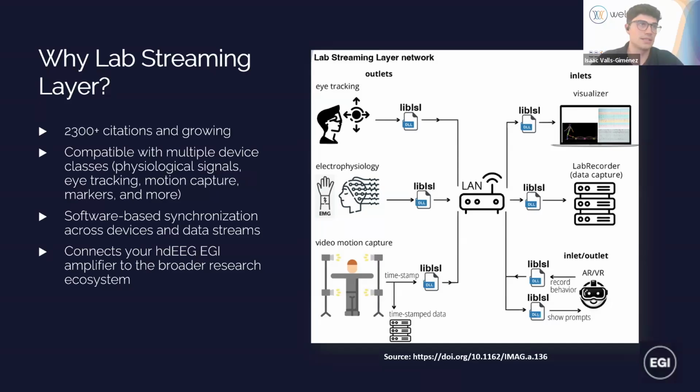So LSL, just as an overview, supports a long list of devices, from physiological streams like EEG to eye tracking, motion capture, stimulus markers, and many other hardware devices. And on the software side, it works across all major programming languages and operating systems, and integrates directly with many other open source tools that researchers are already using.